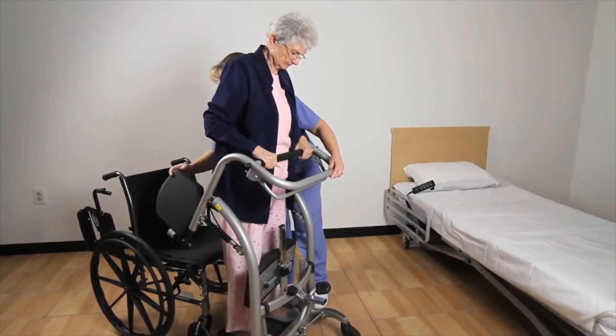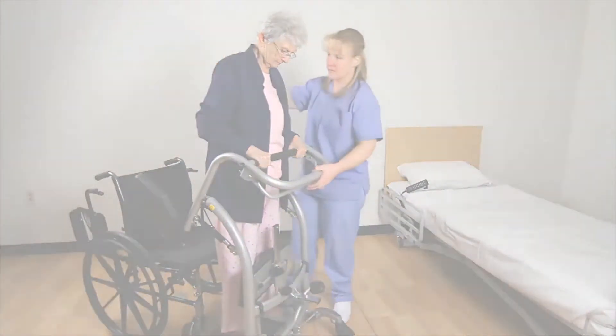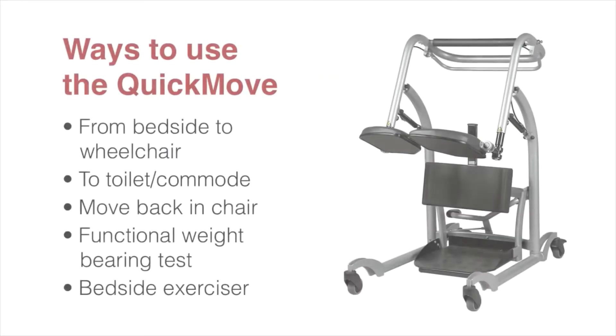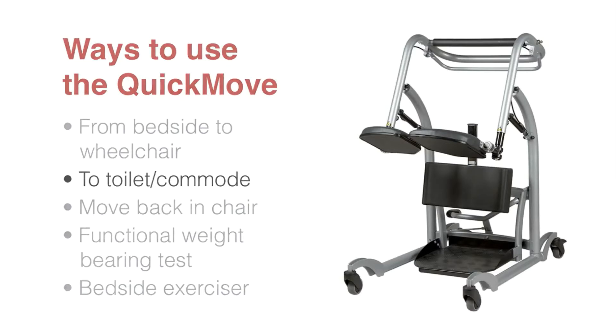Ask the patient to stand up and raise the seat cushions before sitting down in the wheelchair. Release the support straps — do not do this when the strap is tight as the patient may fall backwards. Help the patient lean forward when the straps slacken, then open the buckle and slowly help the patient to a seated position in the wheelchair.